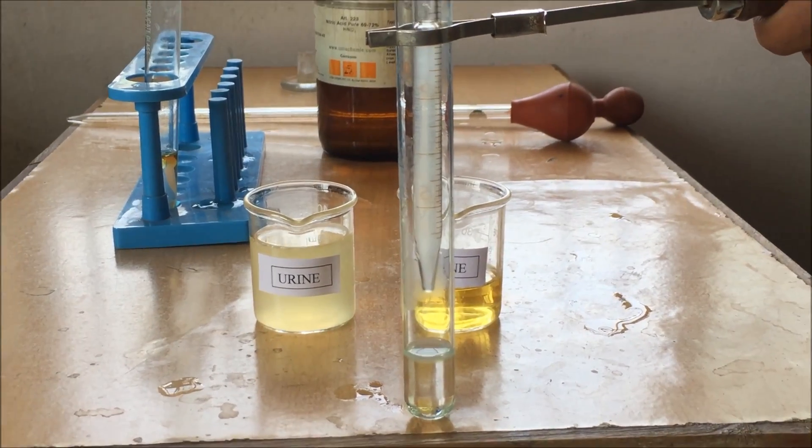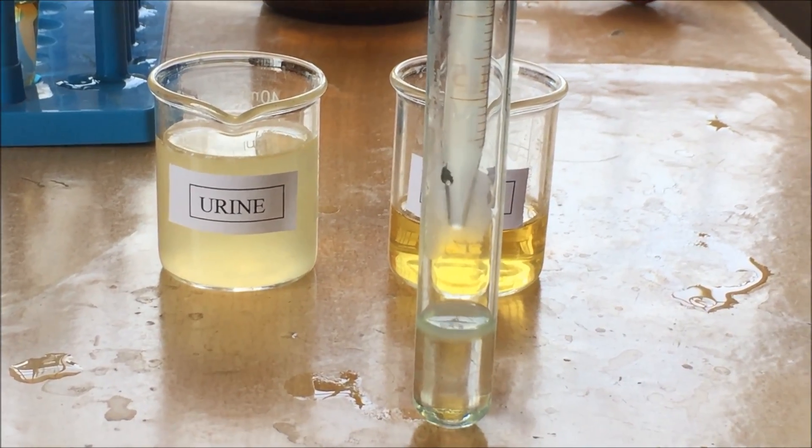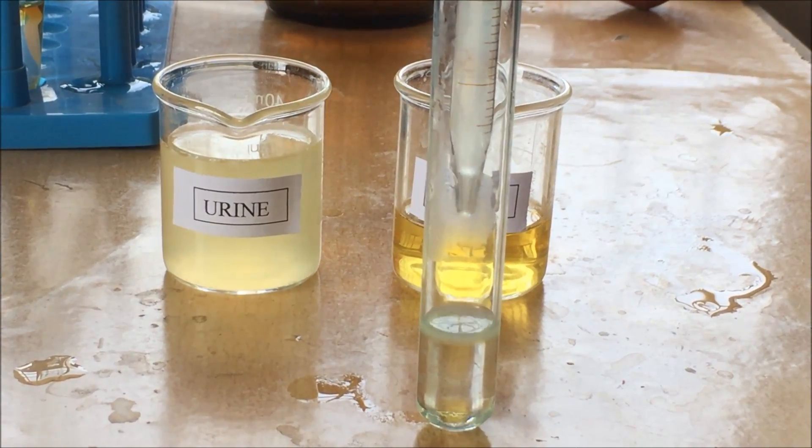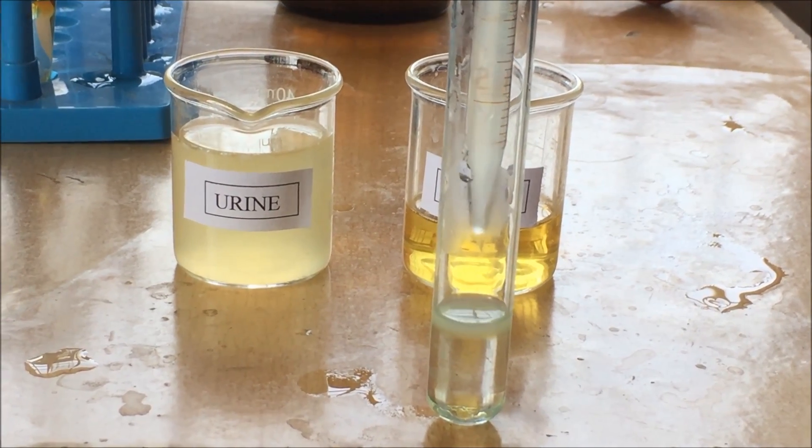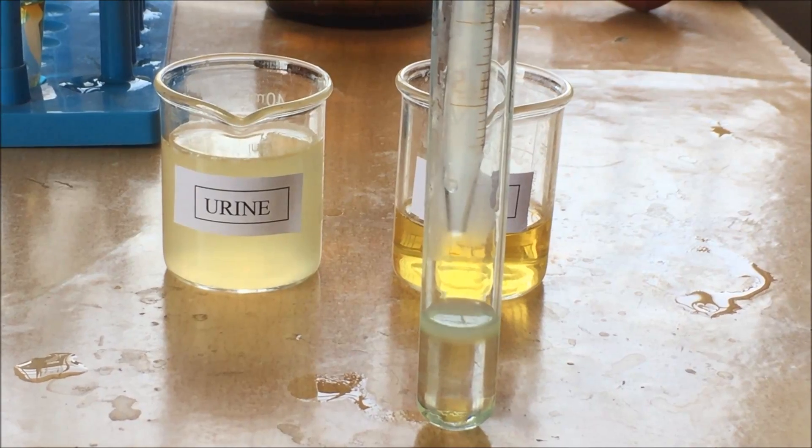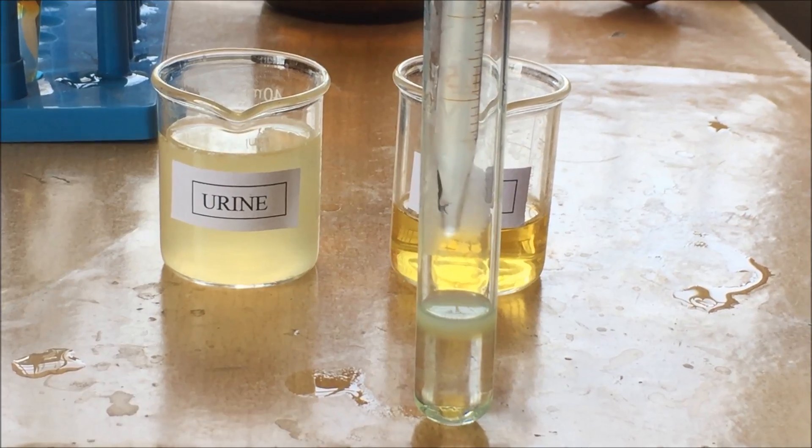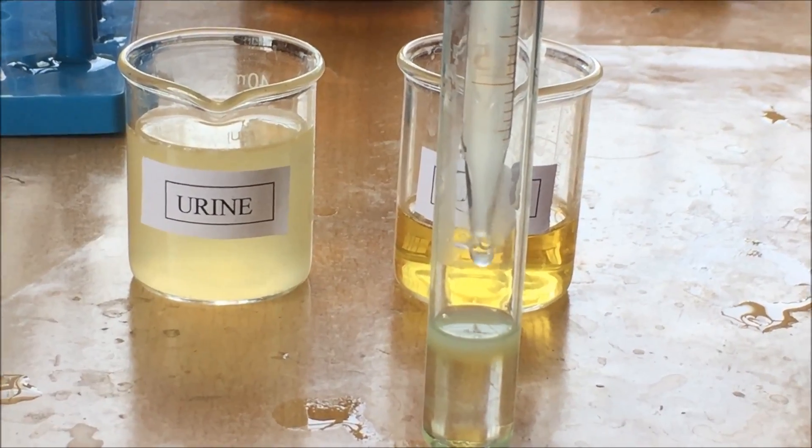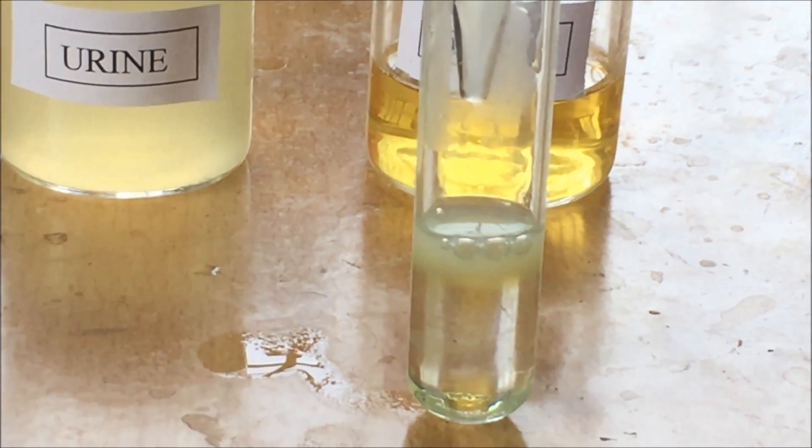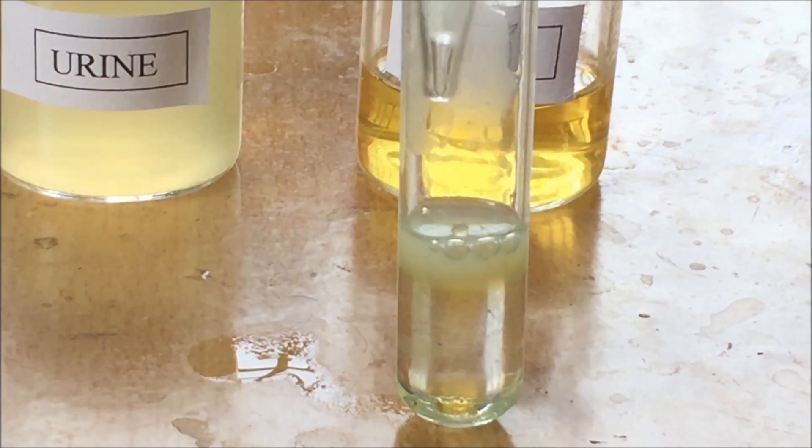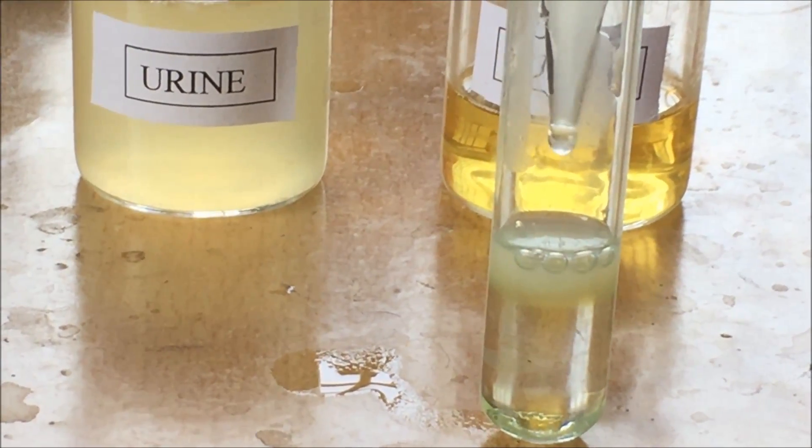I request you to please focus on both layers. As you can see when a drop of urine is added, there is a formation of a white ring over the surface of nitric acid. This is because there is a precipitation of protein, that is albumin protein in the urine sample, due to the interaction between concentrated nitric acid and the albumin. The formation of the white ring over the surface indicates the presence of albumin in the given sample.